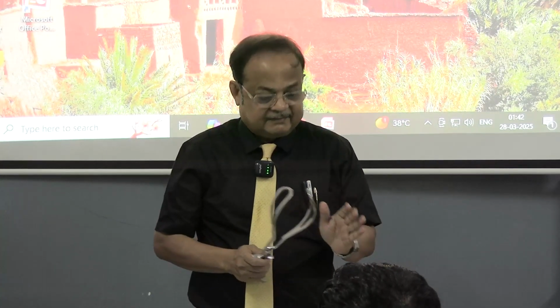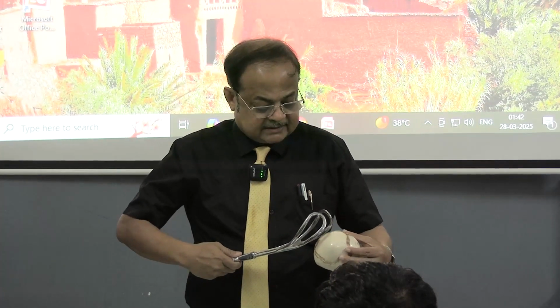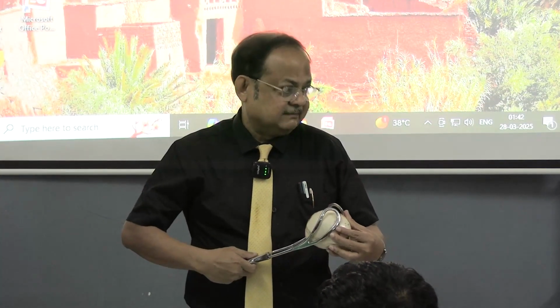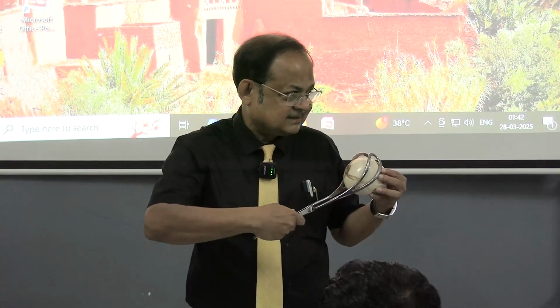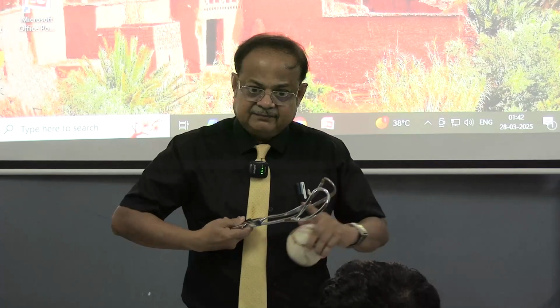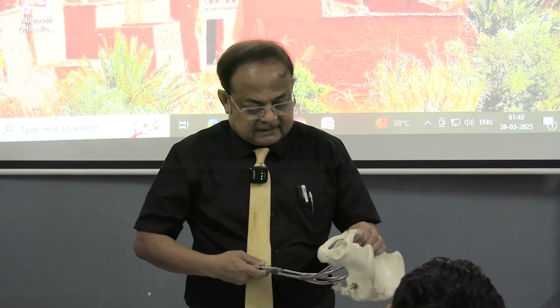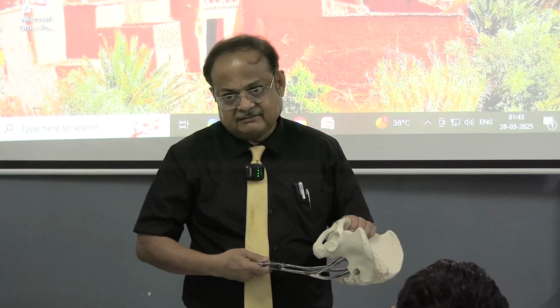So this is about the cephalic application and different diameters: cephalic application, pelvic application, cephalic curve and pelvic curve. Cephalic application, as I have already said, is when the blades are applied about the biparietal diameter of the fetus. The convexity of the biparietal diameter fits along the concavity of the cephalic curvature. And pelvic application is, remembering the sacral curvature, the pelvic application.